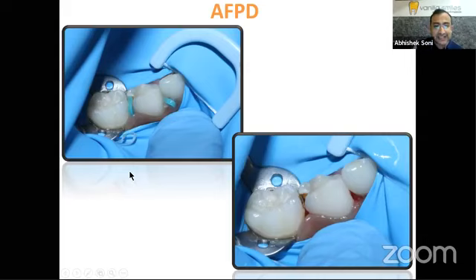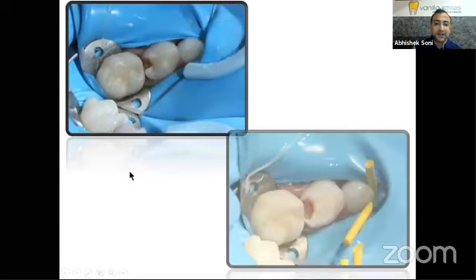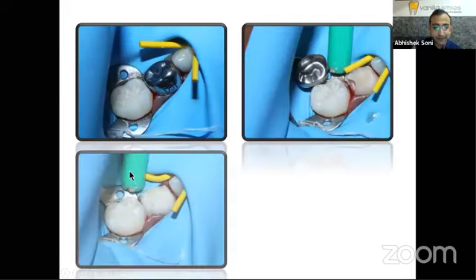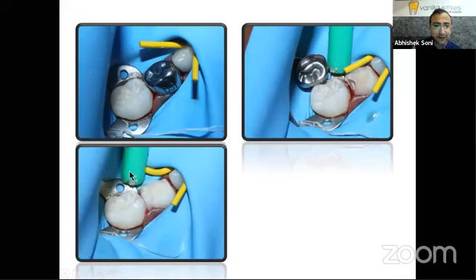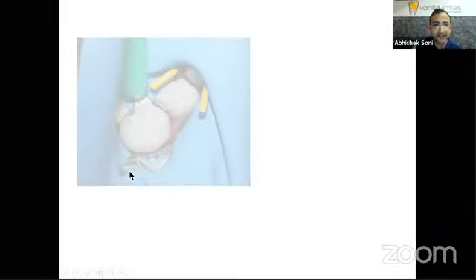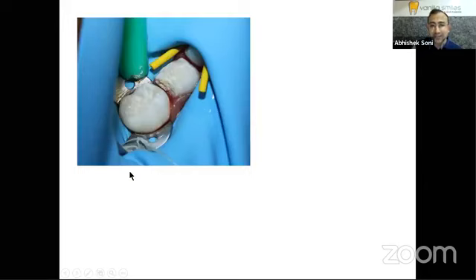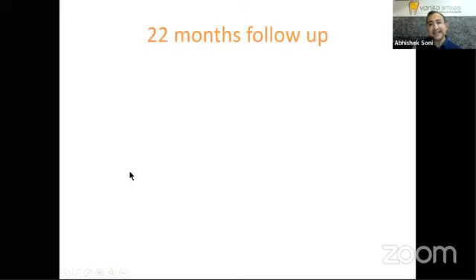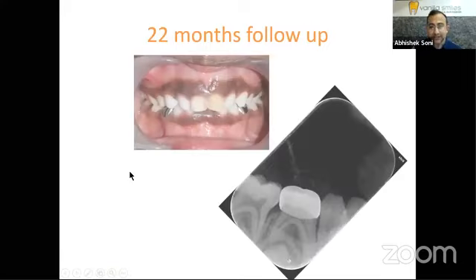We started with selective caries removal, and we encountered a carious pulpal exposure. We decided to disinfect this with 1.5% sodium hypochlorite. We did the crown selection first, disinfected with sodium hypochlorite, irrigated or flushed with saline. The exposure site was covered with Biodentine entirely, including the cavity. The crown selection was already done, so the crown was eventually luted into place. And that's the 22 months follow-up. It's all stable.